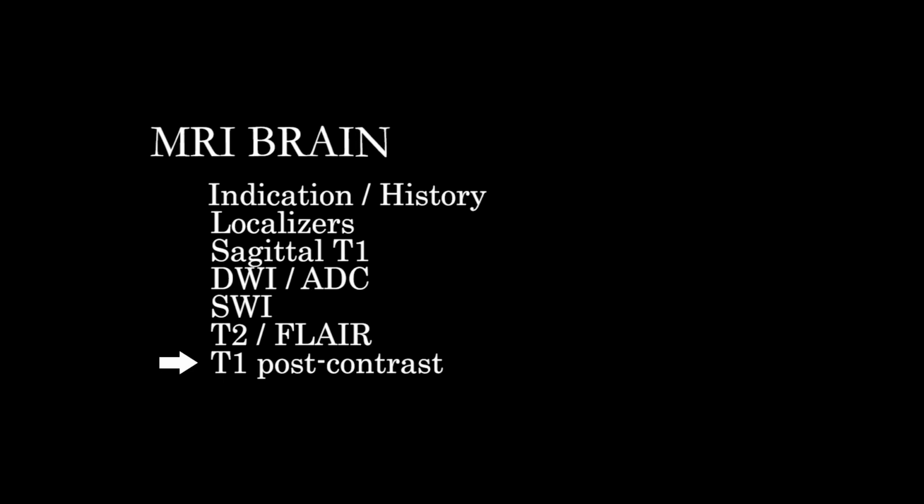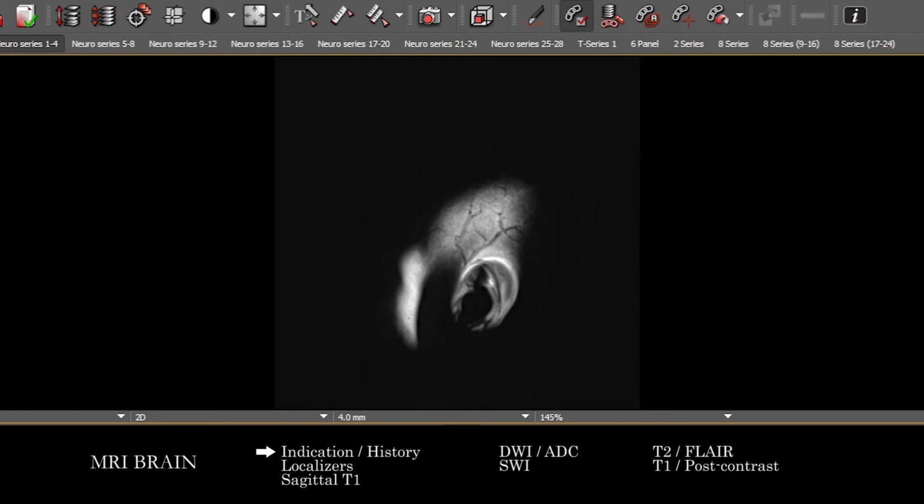All right, so when we do the background reading, figuring out what is happening with the patient and the study indication, we want to get a sense of is there a known abnormality? Is there a primary brain malignancy? Is there an underlying malignancy somewhere? In certain cases, you're going to want to know what is the pathology of any known brain tumor, how is the patient presenting? All this background information is going to inform how you take a look at the exam.